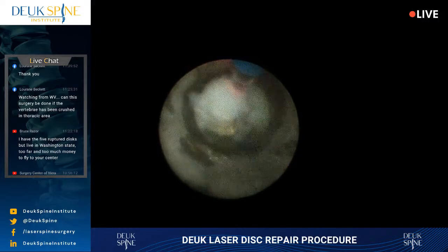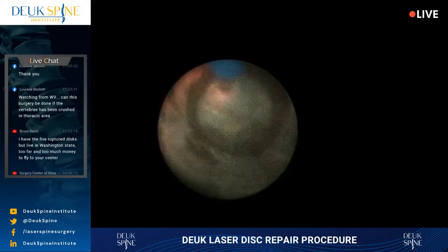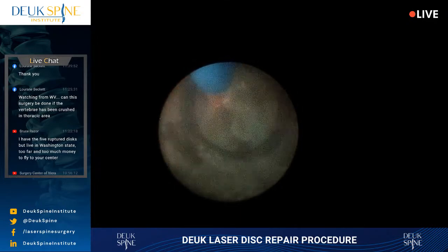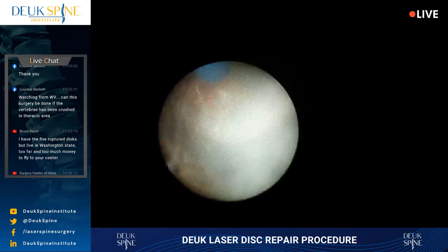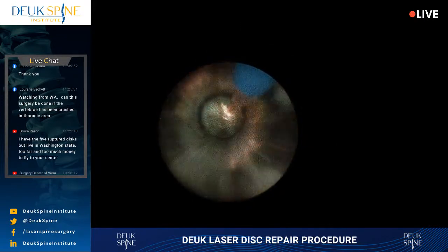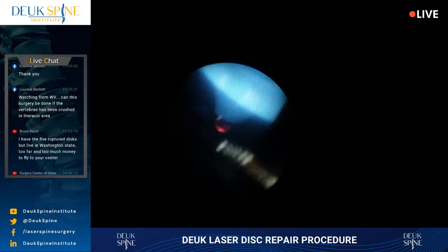And the reason I can float them out is I'm using a saline irrigation going down this tube through an IV. There's a bone spur, and I'm going to have to grab that out. It's too dense.